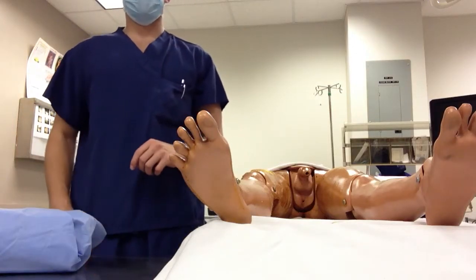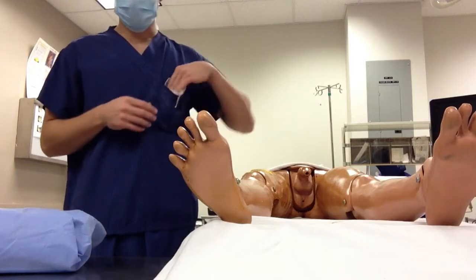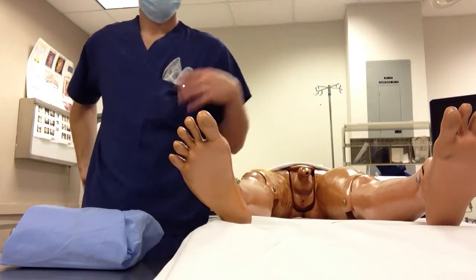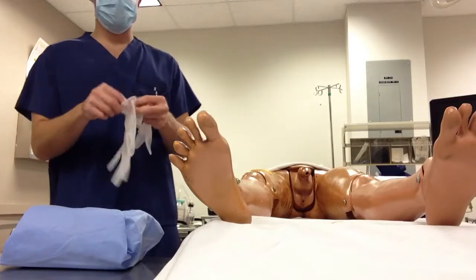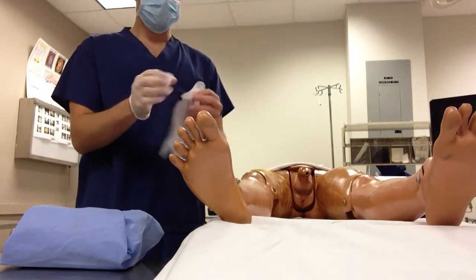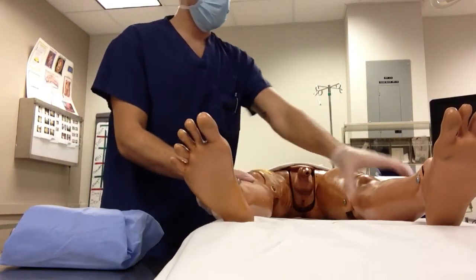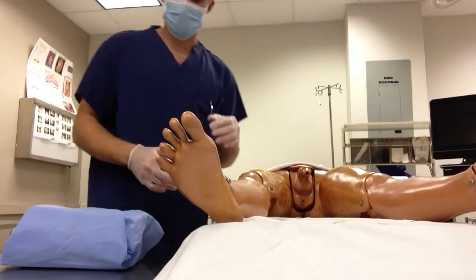I'm going to be showing you how to properly catheterize a male patient. First, make sure you have all your supplies: your cath kit, your sterile gloves, and I use non-sterile gloves just to manipulate the patient so I can better access the urethra. I'll move the patient's legs and spread them out a little bit so I can reach the urethra.